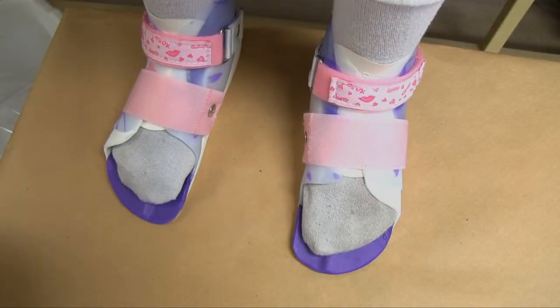Looking at the brace, I want to have enough length at the toe for proper growth and containment on the lateral side to prevent abduction of the forefoot. I want the met heads free so that there's flexibility during push off for this child.